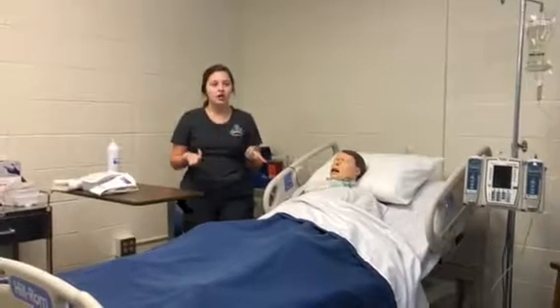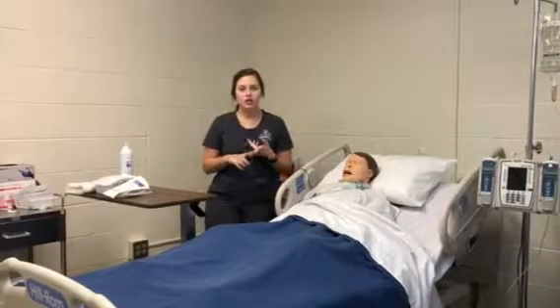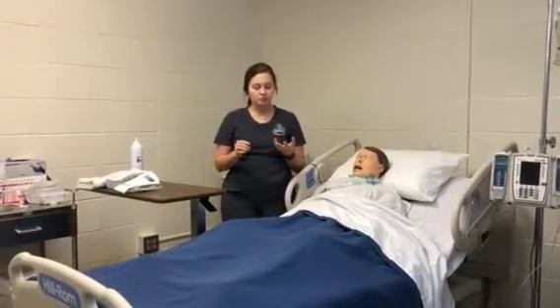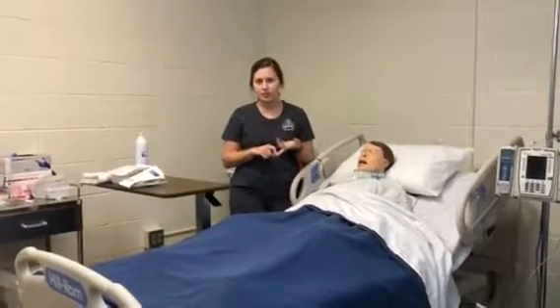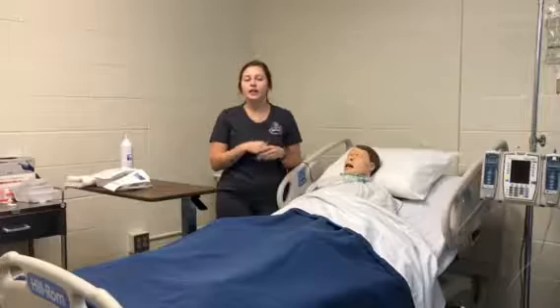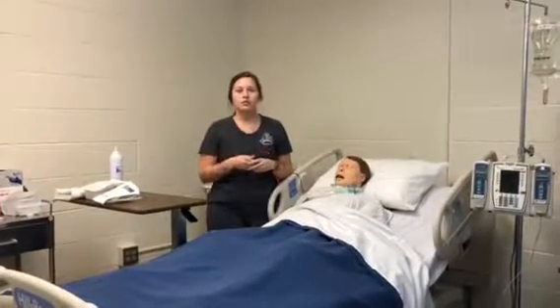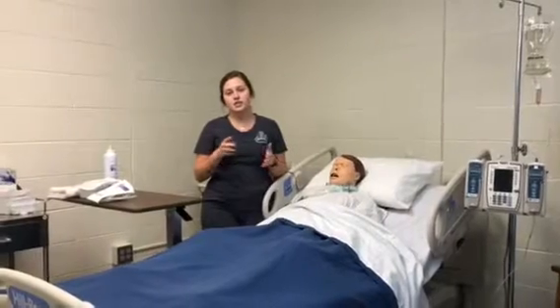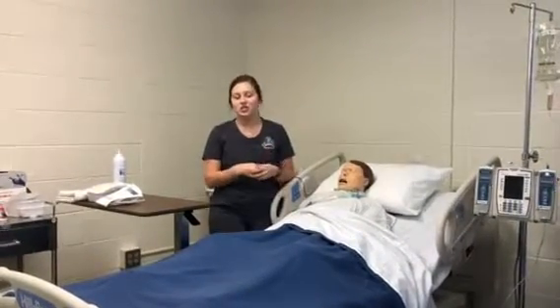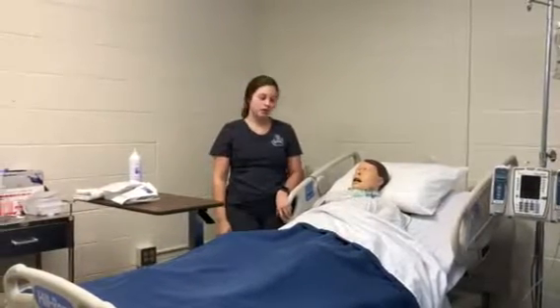Along with that, you'll also want to check irregular pulses, any labored breathing, and then the appearance of the patient, coughing, anything like that. And then after you suction, you want to make sure that you look at the consistency, the amount, all of the gunk that you suctioned out, because you'll need to document all of that later.